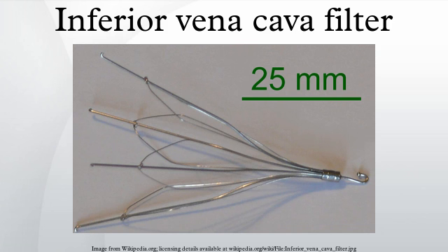Side effects. The main function of a vena cava filter is to prevent death from massive pulmonary emboli. Long-term clinical follow-up studies have shown that this is accomplished in 96% of cases having a standard stainless steel Greenfield filter. FDA communication. The FDA has recently released an initial communication on the risk and adverse events associated with long-term use of an inferior vena cava filter.